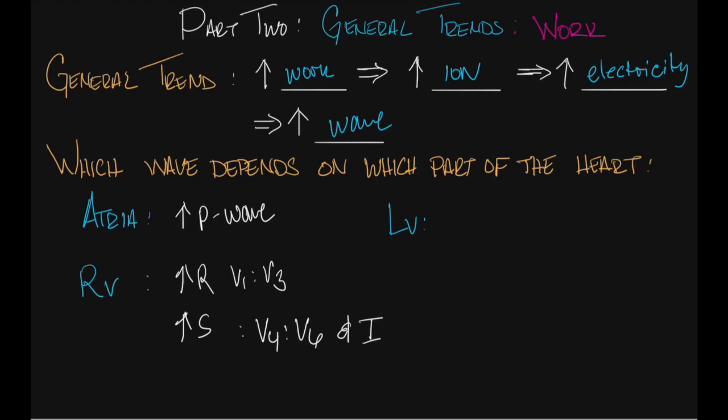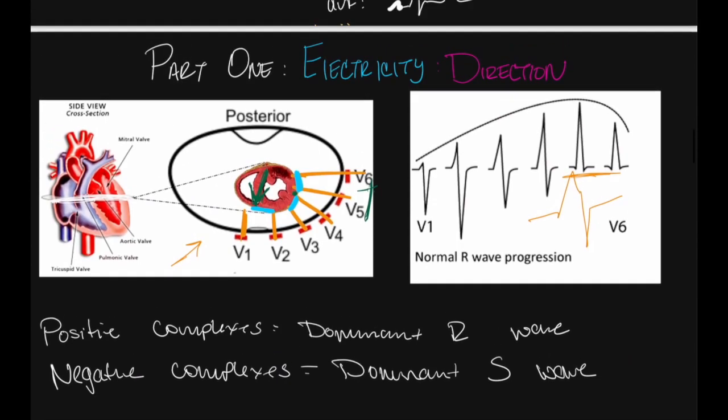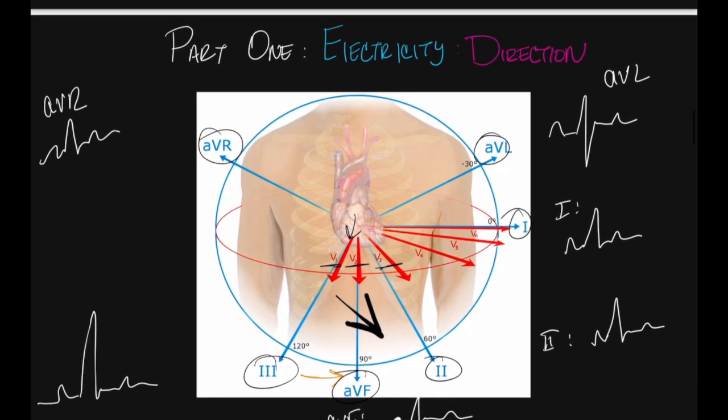And the right ventricle is special in that those leads that look mostly at the right ventricle also peek a little bit at the septum. And one way this manifests itself is you're going to get an increase in Q wave in lead 3. Let's have a quick look back, to make sure we really are comfortable with these ideas.